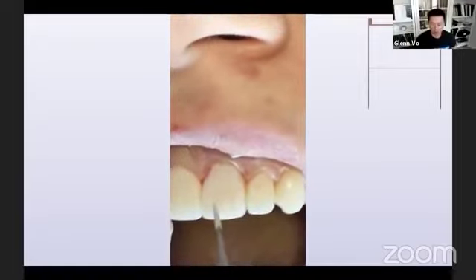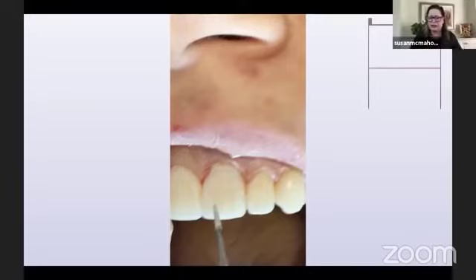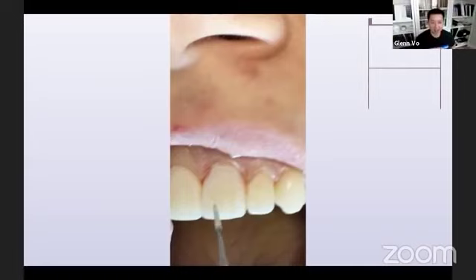And Susan, okay. We have a question from someone who just messaged me. They wanted to make sure that while you were doing that, you were not using any water. Is that correct? That's correct. The coarse diamond is dry, no water at all. And then the follow-up question was, is that a coarse diamond? Yes. But why are you using a coarse diamond?